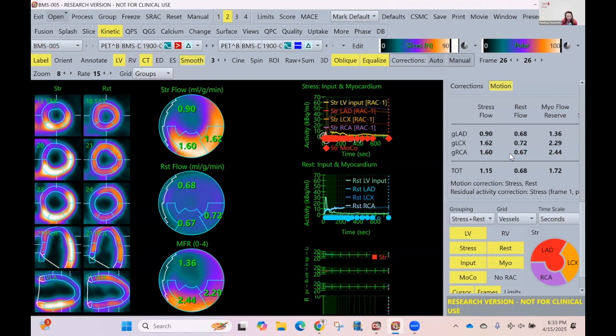And we've seen with other tracers, for example O15 water as well, that we may have different thresholds, different cutoffs for normals versus abnormals for O15 water, and also for stress flow. And so I think this is something that we're learning with each case, and maybe just have to temper a little bit with what we're doing. None of the tracers are actually changing the underlying flow. It's the models for those tracers that may or may not be that great when we're talking about this big a range that we're trying to cover the blood flow from.